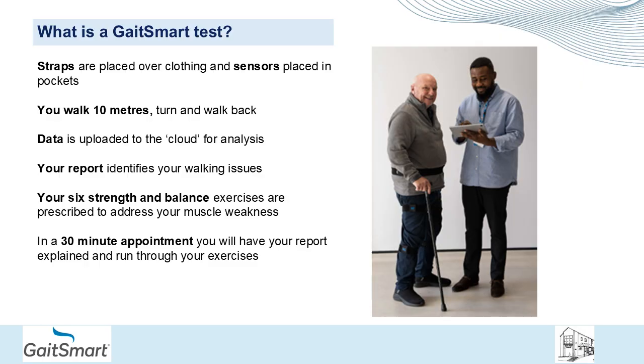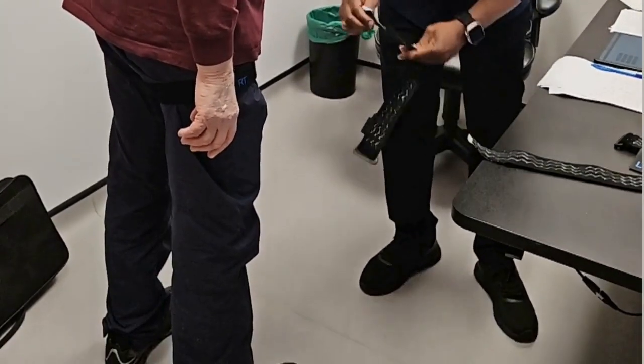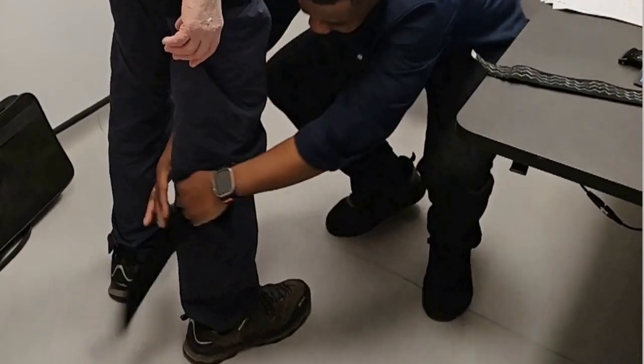This shows tests being done. And then this goes on your right calf.